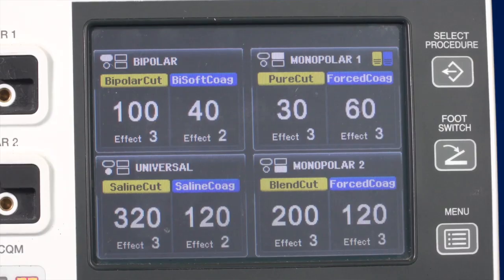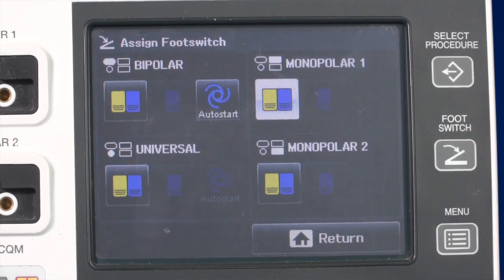Bipolar energy is mainly used for coagulation. The main bipolar coagulation modes used in standard surgery are Bi-soft coag, auto coag and hard coag. Bi-soft coag is the standard bipolar coagulation mode to be used with bipolar forceps; this mode offers the option to assign an auto start function, which is assigned like a foot switch in the foot switch menu. Auto coag is the same as Bi-soft coag but in addition has an auto stop function. Hard coag is used in combination with larger instruments if vessel sealing is required.